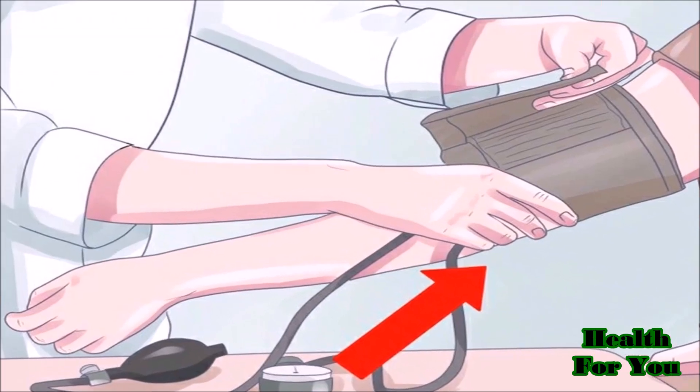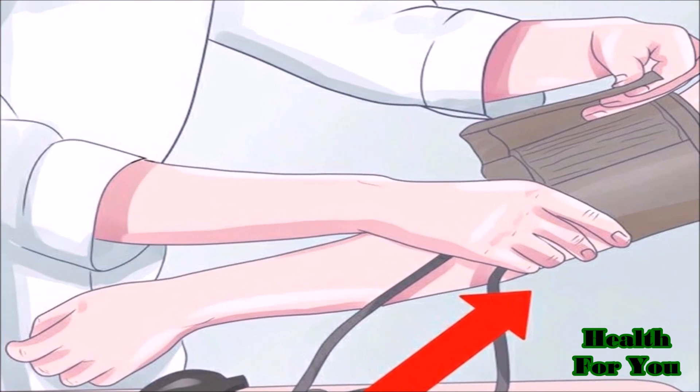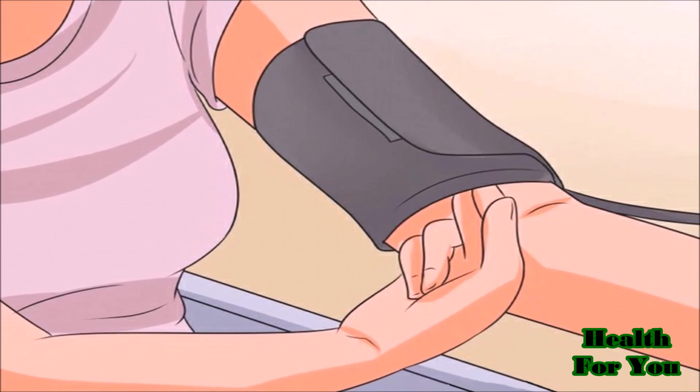Wrap the BP cuff around the patient's arm, about 1 inch above the bend of the elbow, and it should be evenly tied around the arm. It should let only two fingers pass through the cuff.